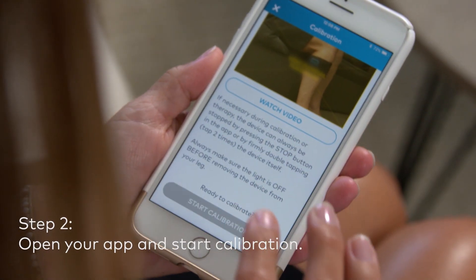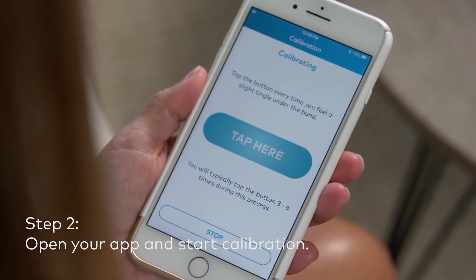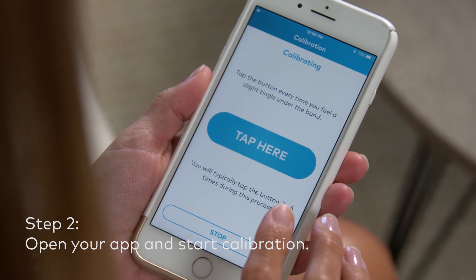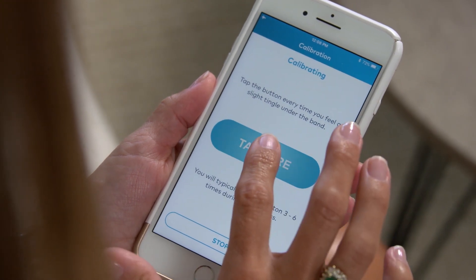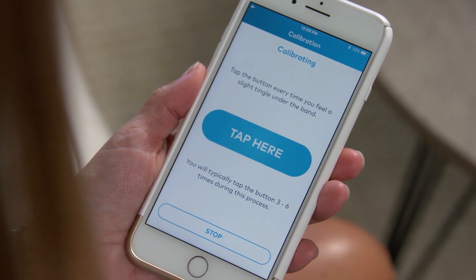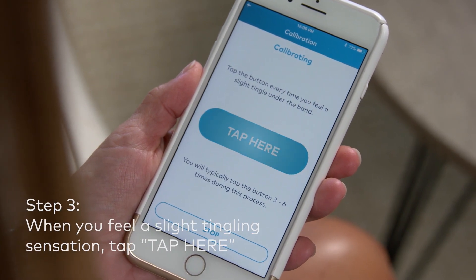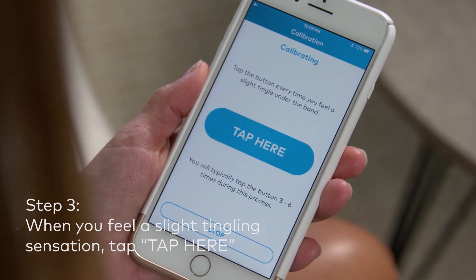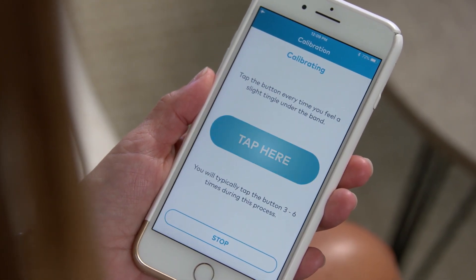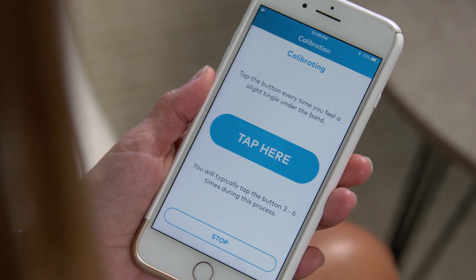To start calibration, you will tap the button within the app that says "Start Calibration." Once calibration has started, you will see a pulsing blue button that reads "Tap Here." Wait until you feel the slightest tingling sensation under the electrode, then tap. It may take up to 15 seconds before you feel the tingling sensation, as the stimulation slowly increases.